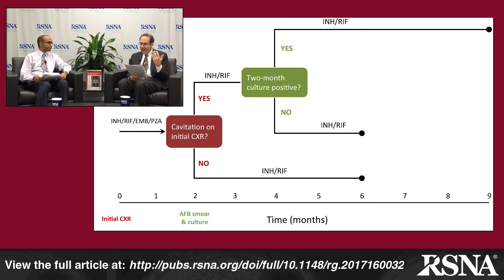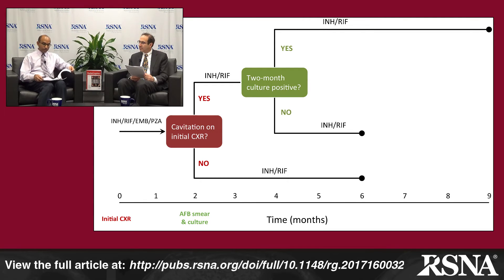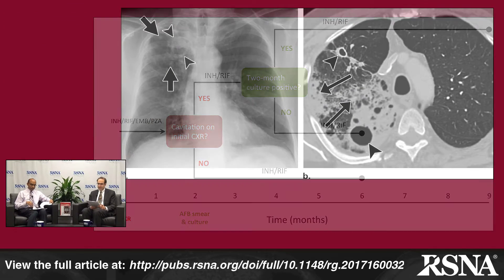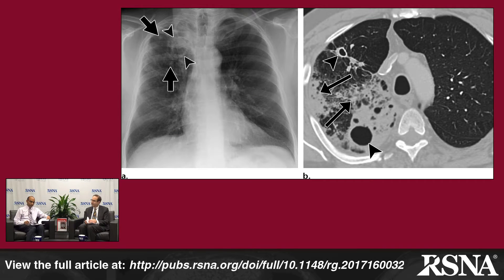Consolidation, cavitation, and centrilobular nodules are hallmark imaging features of active post-primary tuberculosis. Looking at figure 11, which has the chest x-ray and CT, the arrows point to consolidations — airspace opacities with air bronchograms visible on CT. On a non-contrast CT, vessels would be hard to see through areas of consolidation. The arrowheads depict cavities or rim opacities with internal lucencies, which are easier to see on CT, though management pathways are really dependent on whether cavitation is seen on the chest x-ray.